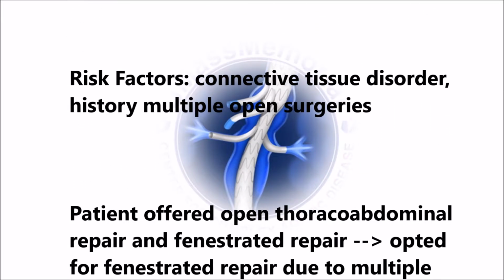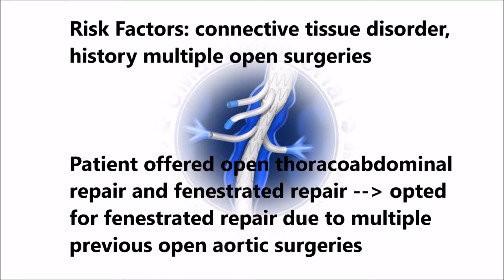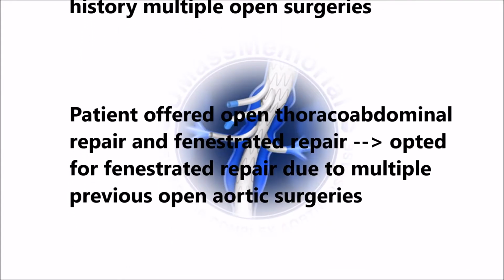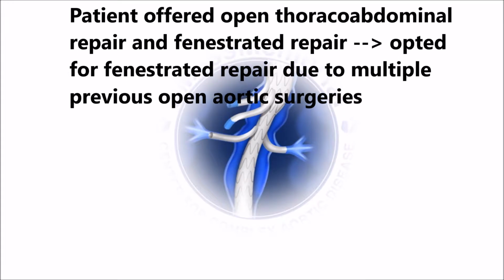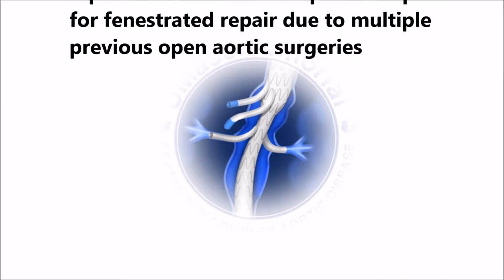He was unwilling to undergo any further open surgery after his previous experiences. We offered him either open thoracoabdominal repair or fenestrated repair. He opted for fenestrated repair due to his experience with multiple previous open aortic surgeries.